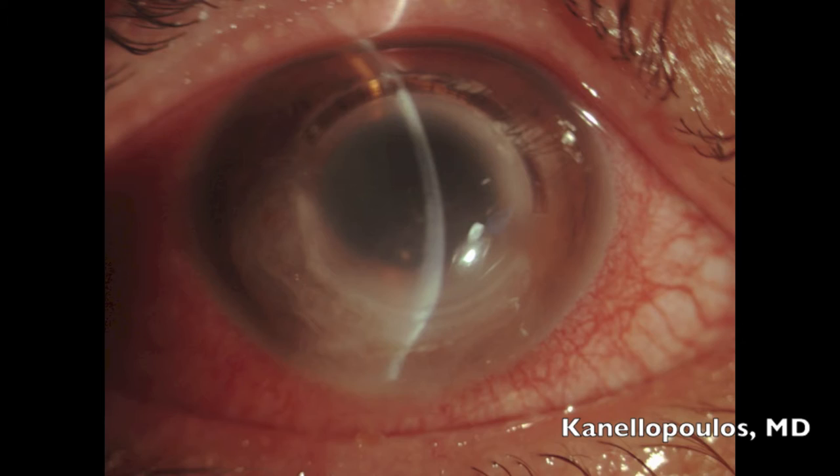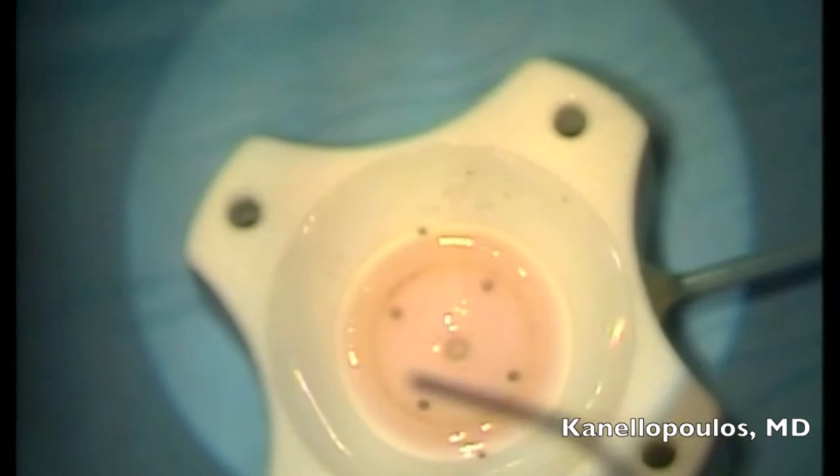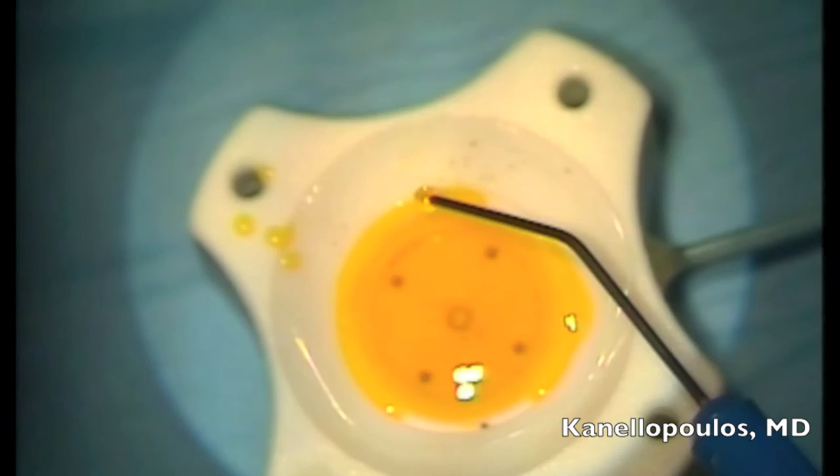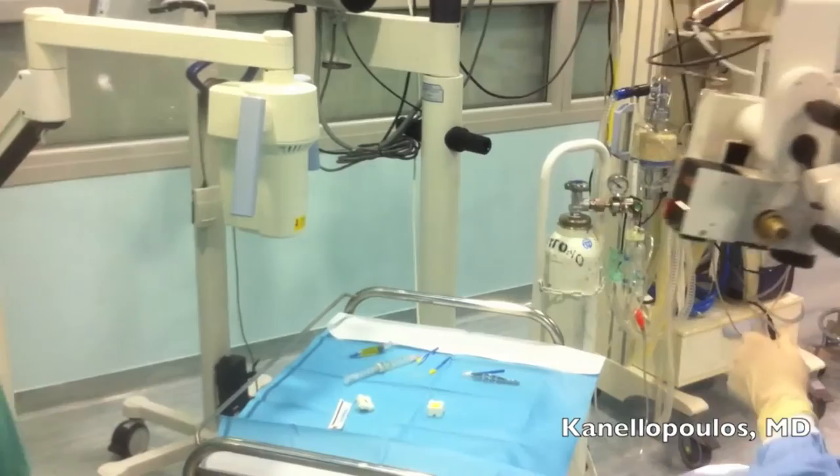Following that, we decided to perform, instead of a penetrating graft, a patch graft. This is the preparation of the patch graft — it is the anterior 450 microns of the cornea. The actual donor cornea was used for a DSAEK case.